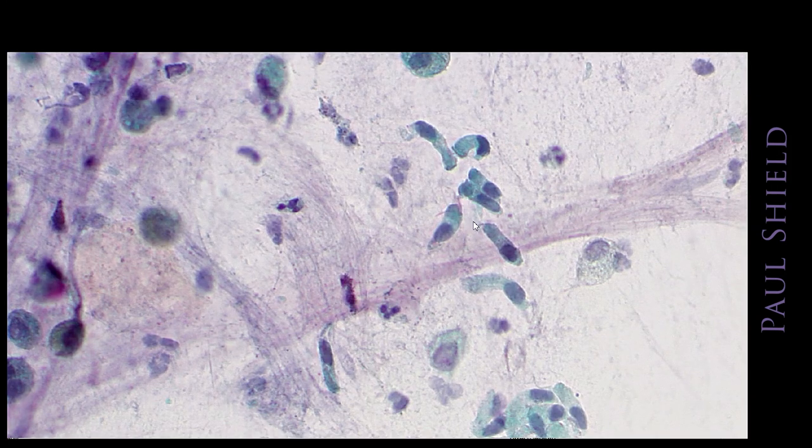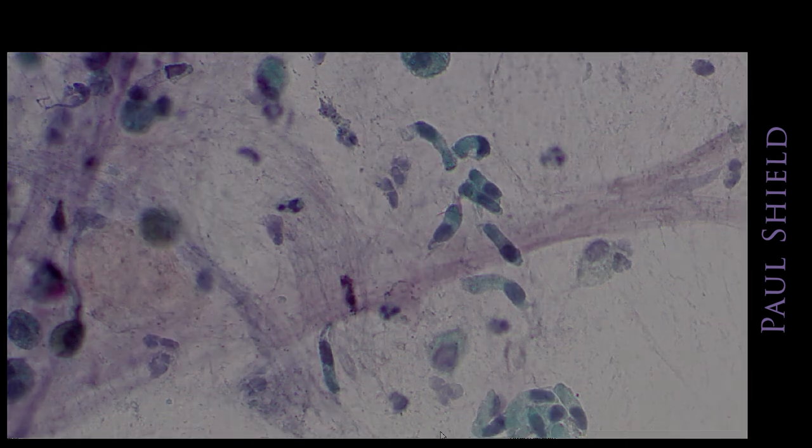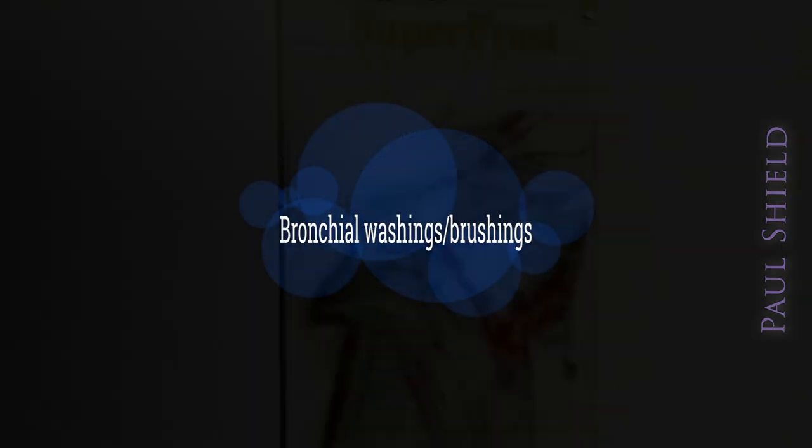These have typical histiocytic morphology, so round cells, foamy cytoplasm, often with ingested material, a nucleus that's often eccentric. The other thing you see in sputa sometimes are bronchial epithelial cells like this. They're quite a tall columnar cell, as you can see. You don't always see cilia, particularly in sputa. They're fairly fragile. I can see it on that one cell there. Often what you'll just see is like a terminal bar where the cilia would meet the cell. So these are not terribly common in sputum, but very common in bronchial washing specimens. And that's what we'll look at now.